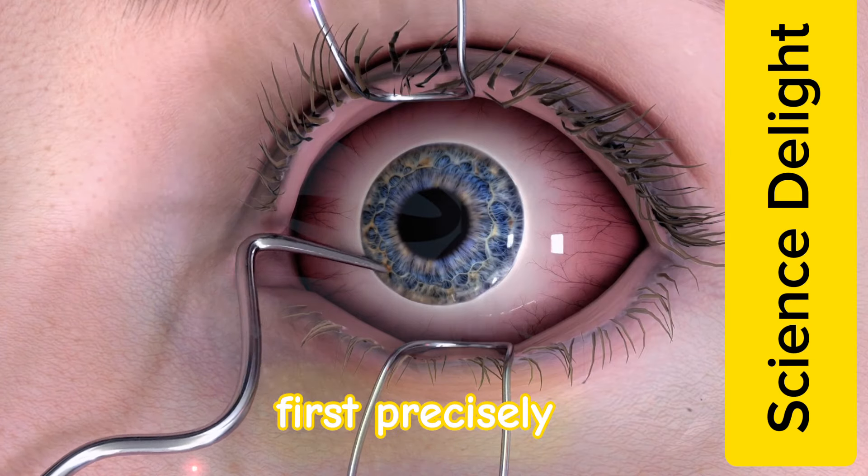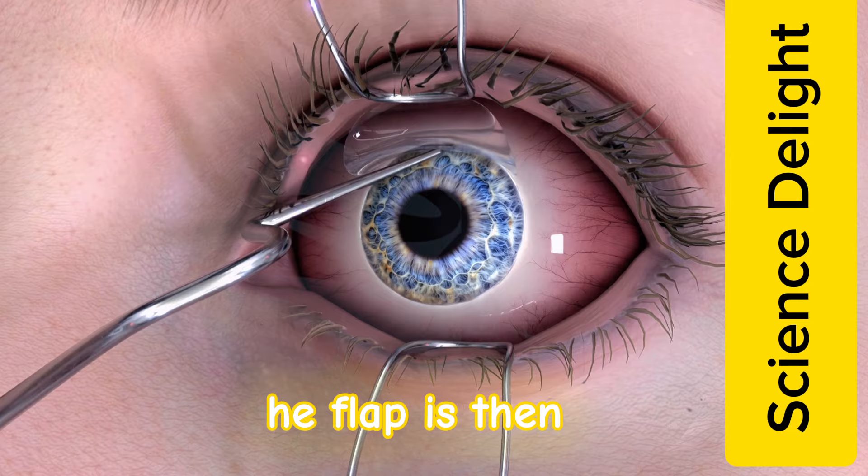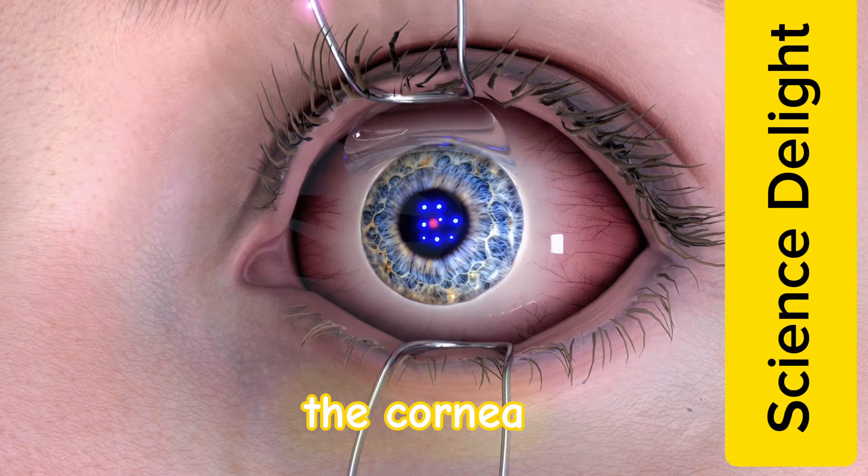First, a thin flap is precisely created on the cornea. The flap is then lifted, and a laser reshapes the cornea to correct your vision.